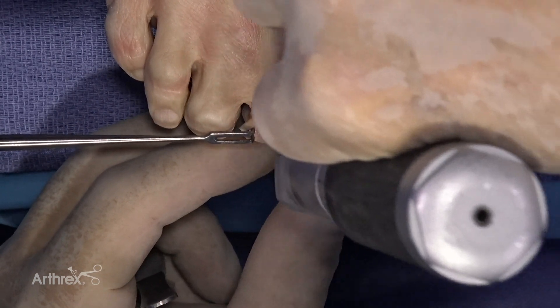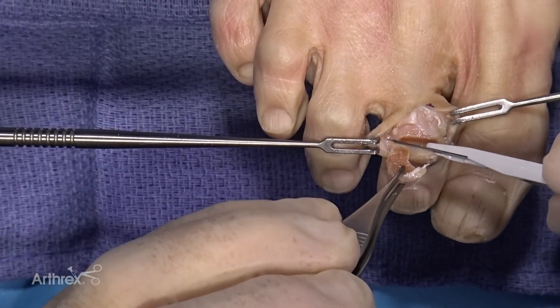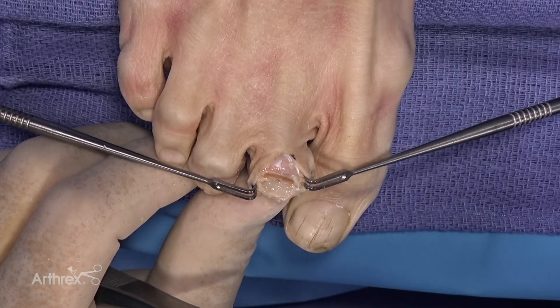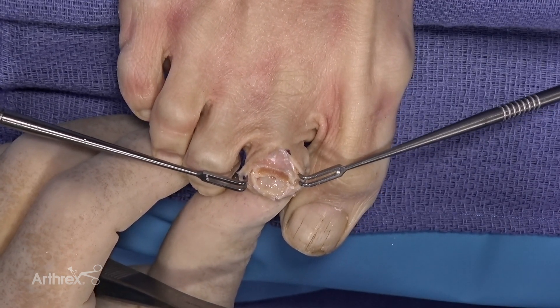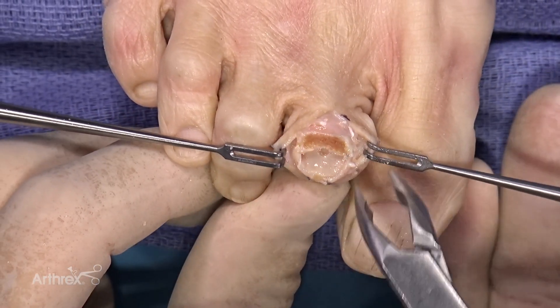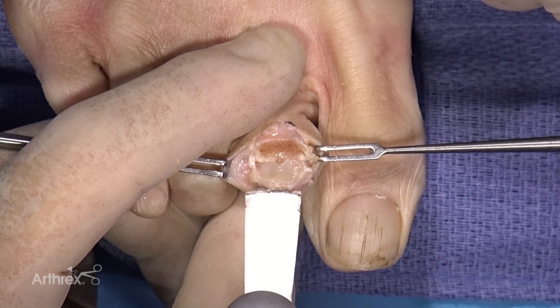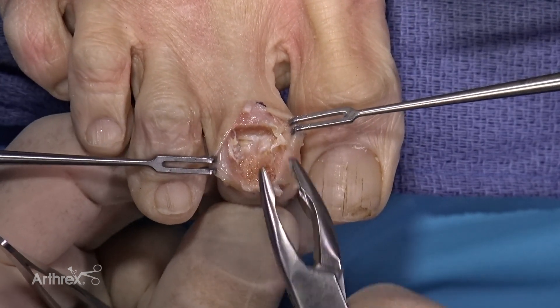We excise the entire dorsal capsule and peel that off of the distal condyle of the proximal phalanx. With the toe flexed, we grasp the distal fragment, resect it, and now we have a very flat cut in this region. It's important to downsize the condylar region a little bit to avoid the possibility of an interdigital corn, which can develop if you have a prominent condylar region. So we remove a little bit of the condyle and do a flat cut with the saw, giving us two very nice surfaces.